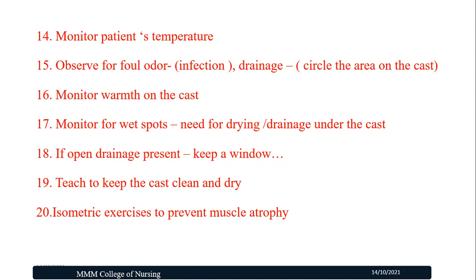Monitor the wet spots which require drying or drainage under the cast. So if there are any wet spots, we need to be careful in observing the wetness. If there is any open drainage present as shown in the previous picture, keep a window and bivalve the cast.